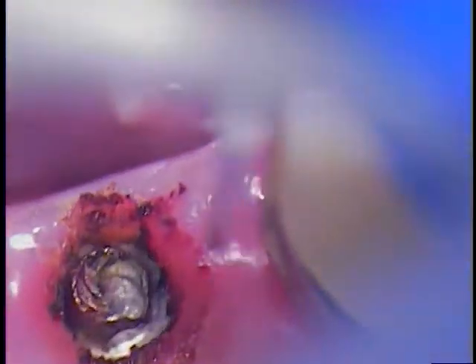Alright, maybe just a little bit more on the papilla, and then I think we have enough room for our driver to go in there. I want to get a positive seat.